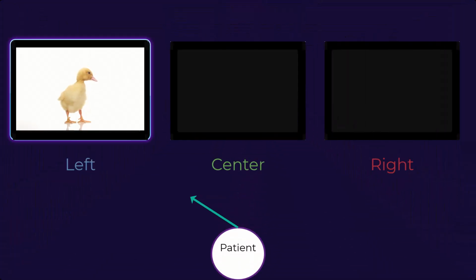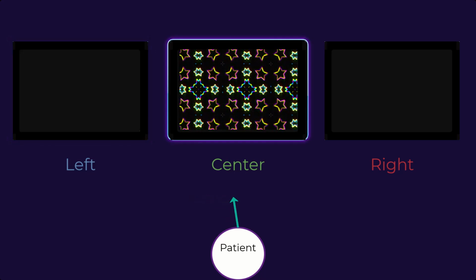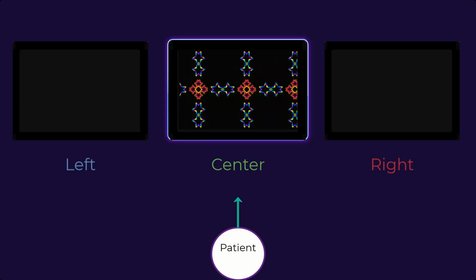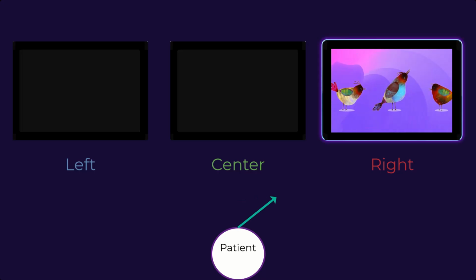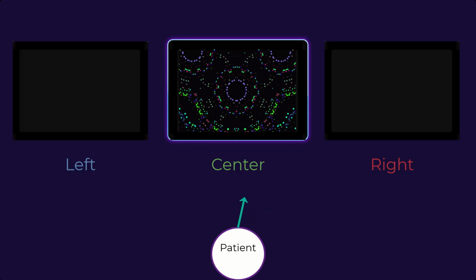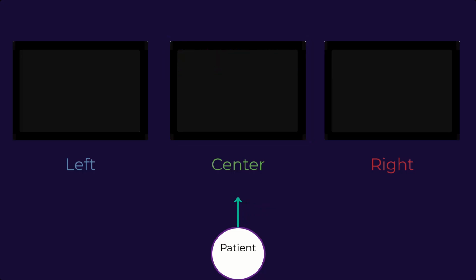Let's activate left, and you see we get the attention there, and we bring them back to center with a simple geometric pattern, a little less interesting than what's happening on the left and the right. And we'll show an example of this over on the right. And back to center. So again, the whole point of this is that we get consistent behavior during the test, and the child stays relaxed, but their strongest visual interest comes from the side reinforcers, not the center.